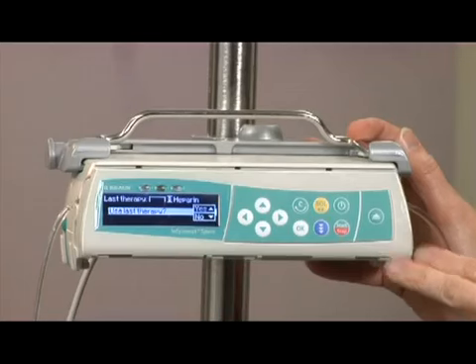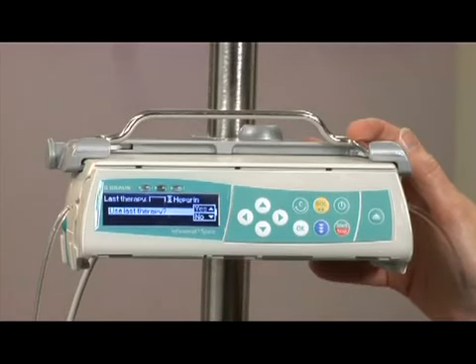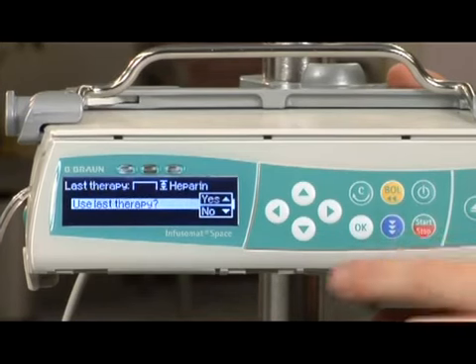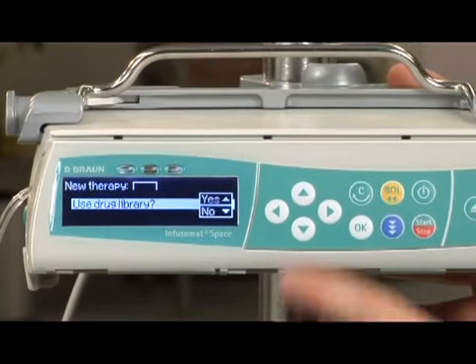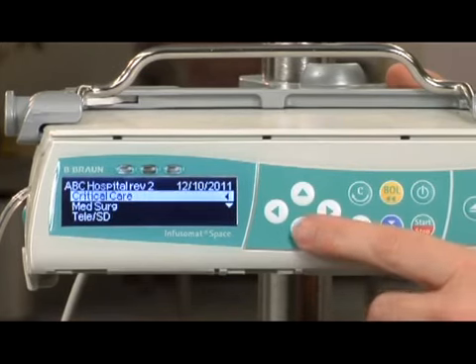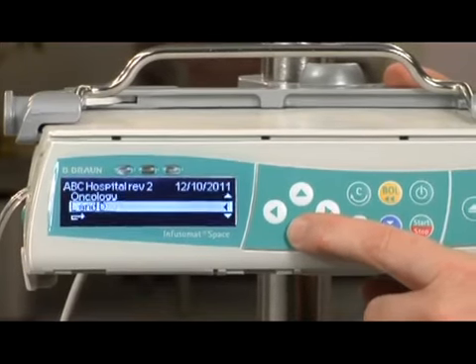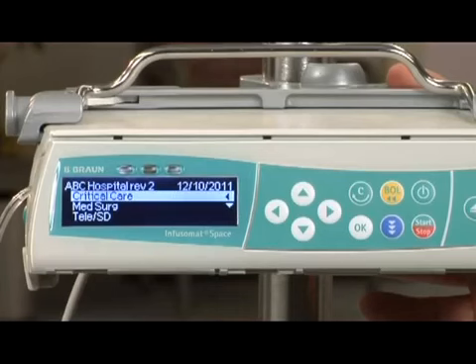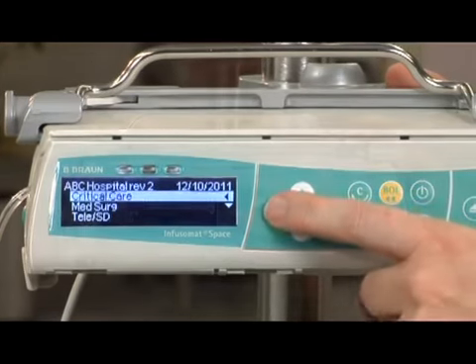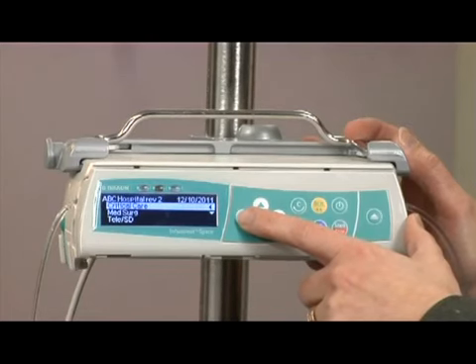The pump will prompt you to walk through the programming sequence. Follow the directional arrows to answer programming questions on screen. Use Last Therapy: answering yes loads the last programmed entry. The drug name is detailed on the pump, in this case heparin. Answering no requires complete programming. We are going to answer no and program from the beginning, and answer yes to use the drug library. Drugs, concentrations, and limits have been customized for specific clinical areas. Find the desired care area by navigating with the up and down arrow keys. The screens always loop back to the top. The screen will also provide arrow prompts to assist in directional arrow key programming.